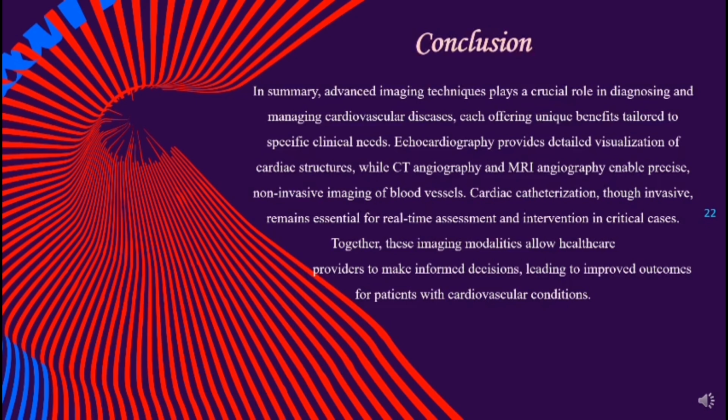Cardiac catheterization, though invasive, remains essential for real-time assessment and intervention in critical cases. Together, these imaging modalities allow healthcare providers to make informed decisions, leading to improved outcomes for patients with cardiovascular conditions.